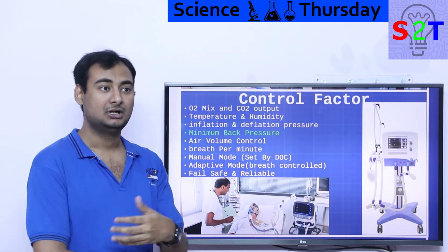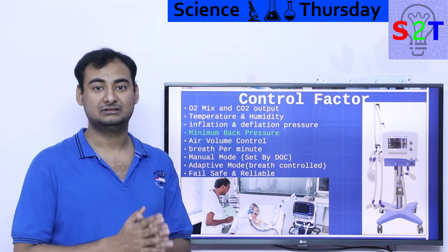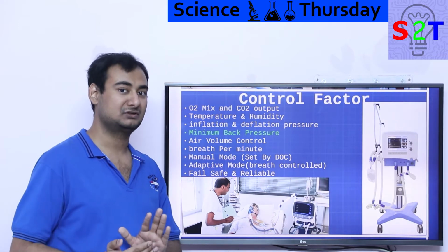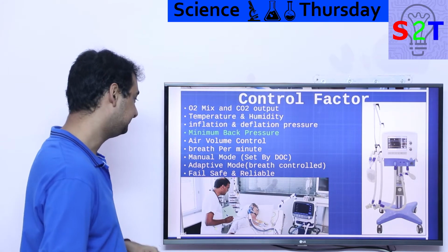You cannot be like, okay, fluids are filling in, so I'm going to pressurize it. Now you're going to destroy whatever remaining lung is there. So you have to compensate for the pressure, but not too much. You don't want fluid to directly suffocate the person.